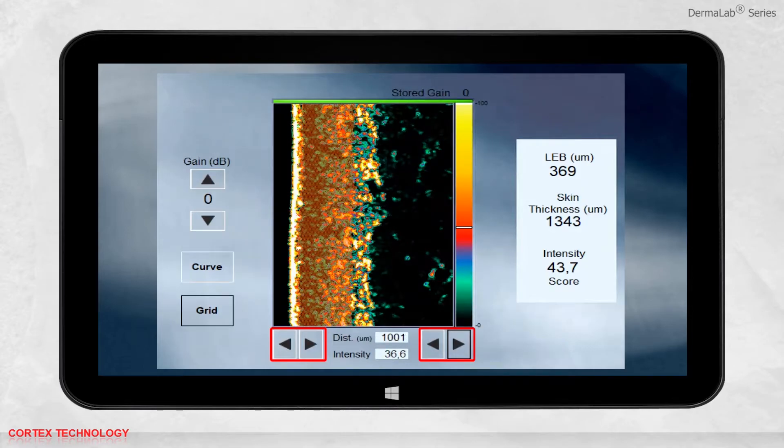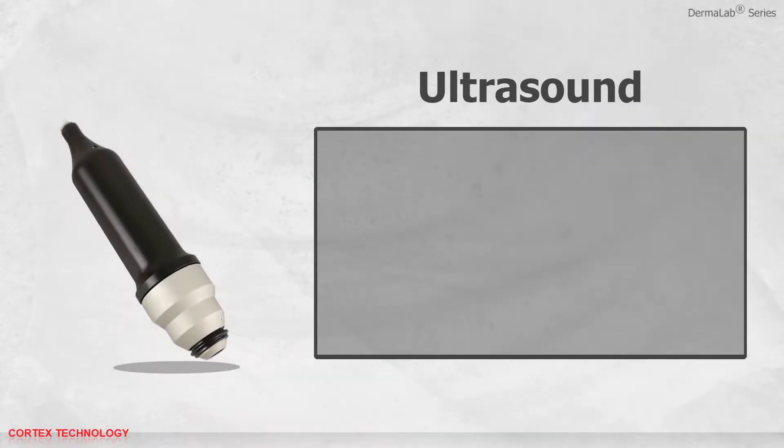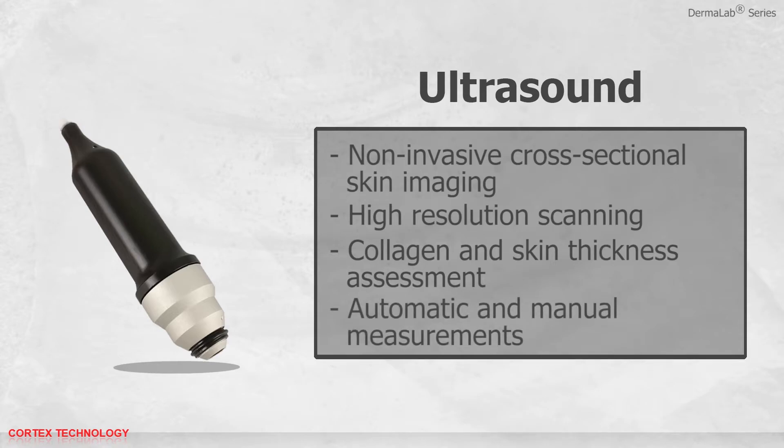The left and right borderline of the grid automatically adapts to the contour of the epidermis. The position of the left and right borderline may be adjusted by pressing the arrows. The distance measurement refers to the distance between the left and right borderline; the intensity measurement refers to the average intensity within the grid. You can save, print, or open previously saved data. The ultrasound application features non-invasive cross-sectional skin imaging, high-resolution scanning, fast and easy collagen and skin thickness assessment, and both automatic and manual measurements.